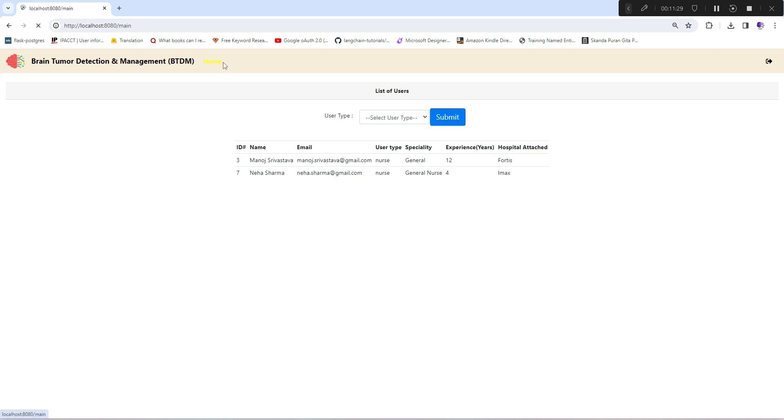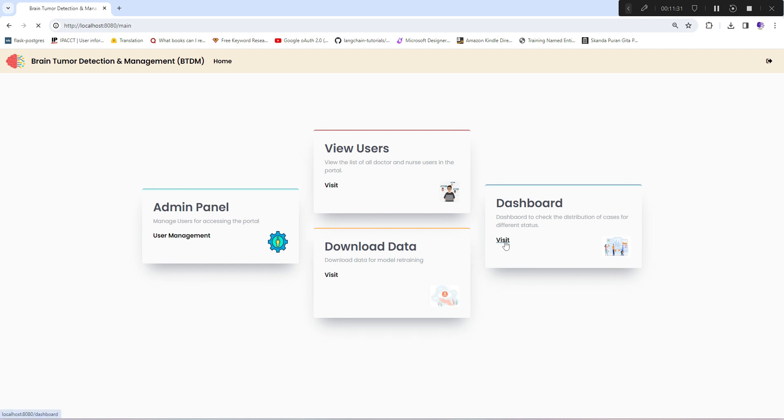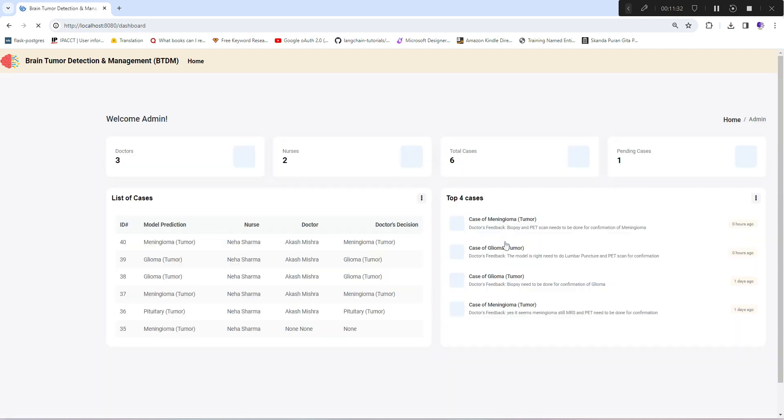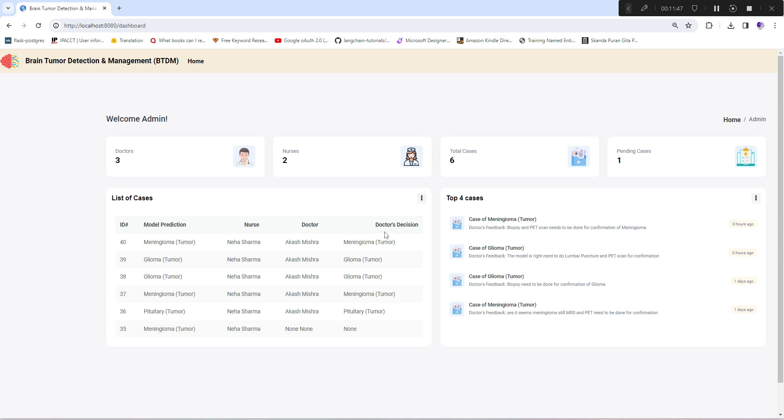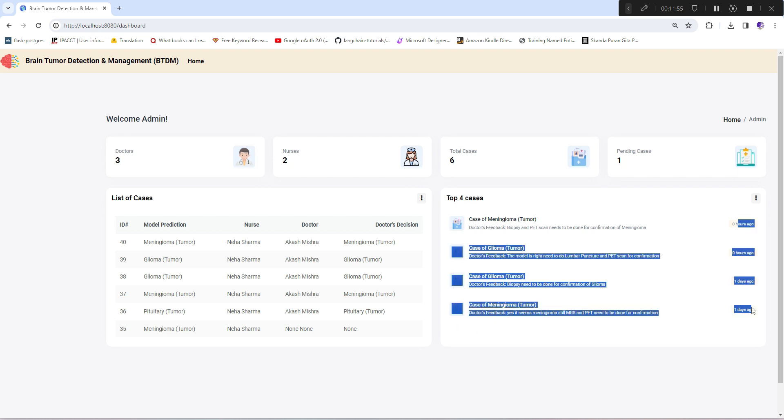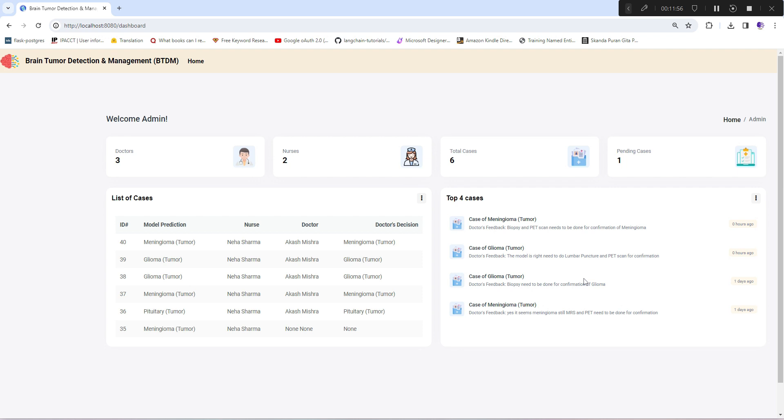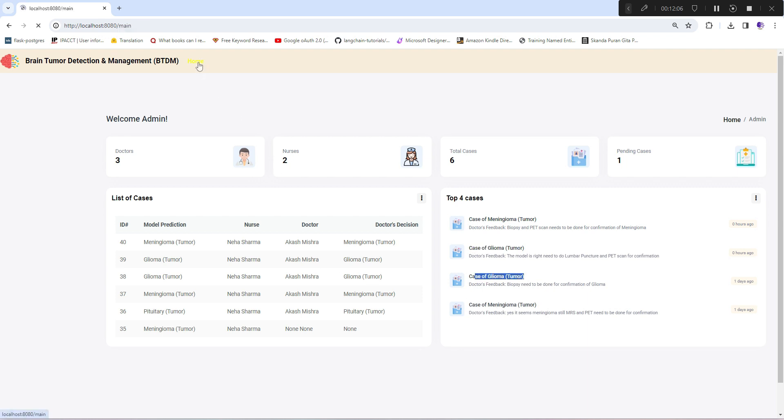Next option is the dashboard, which is similar to what we showed in skin cancer detection management: number of doctors, nurses, total cases, number of pending cases, list of cases along with doctors and nurse details and final doctor's decision. These are the top four last recent cases along with the time when it came and doctor's feedback.